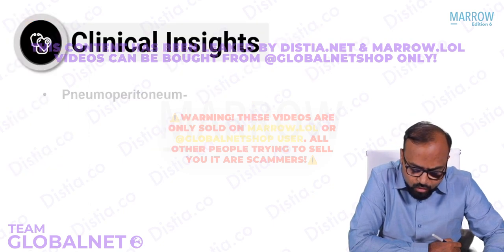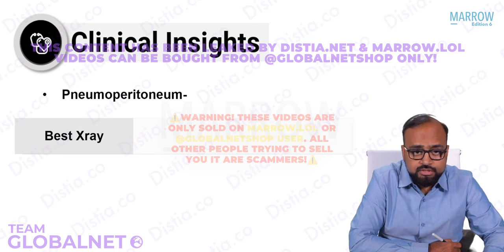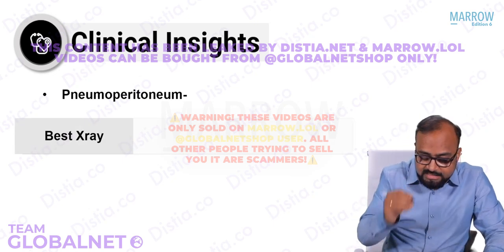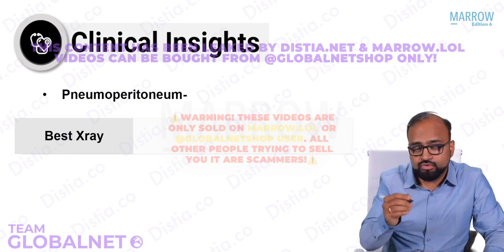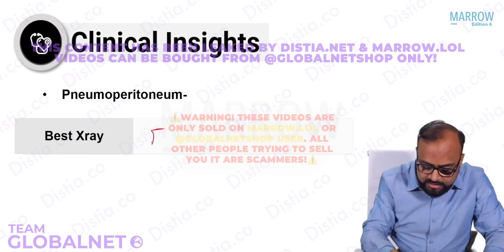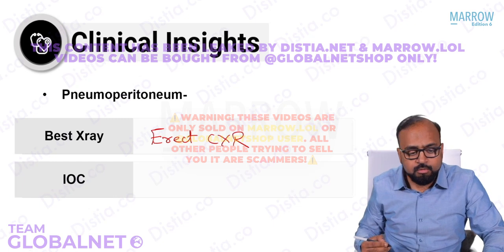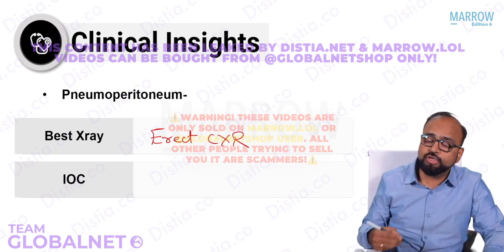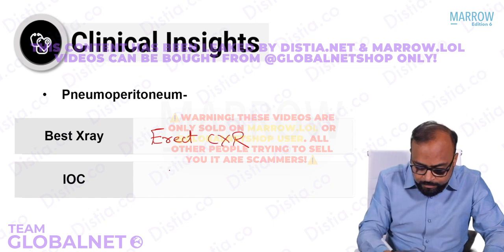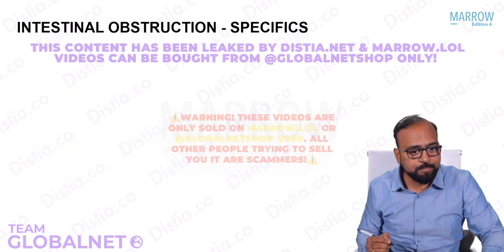Now, what clinical insights have we got from this particular discussion? This is important. What is the best X-ray or best radiograph for detection of pneumoperitoneum? We discussed it with the use of graphics also, right? An erect chest X-ray is considered to be the best X-ray for minimal pneumoperitoneum. But what is the overall investigation of choice? Anywhere in the body you want to detect minimal quantities of air, what will you do? The best investigation will be CT scan for pneumoperitoneum.